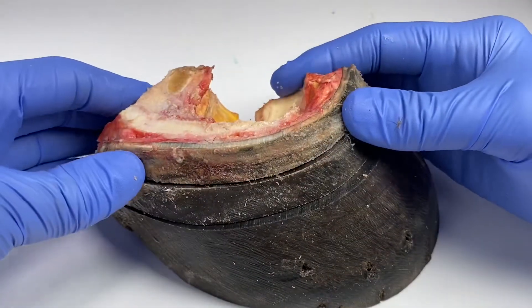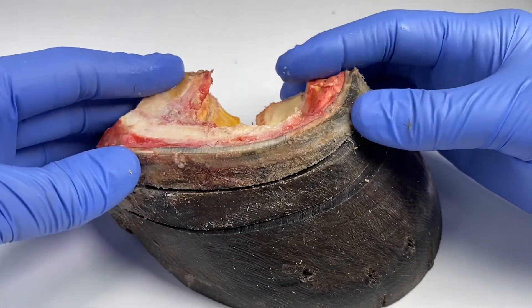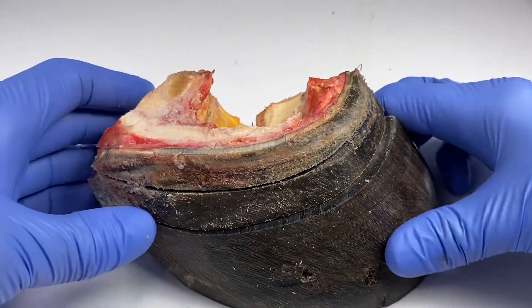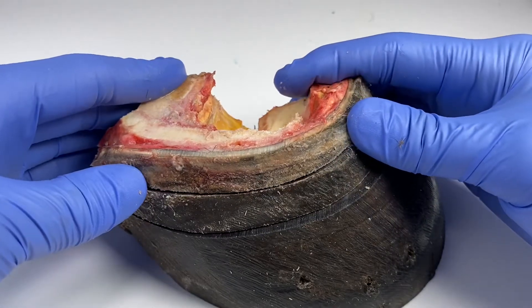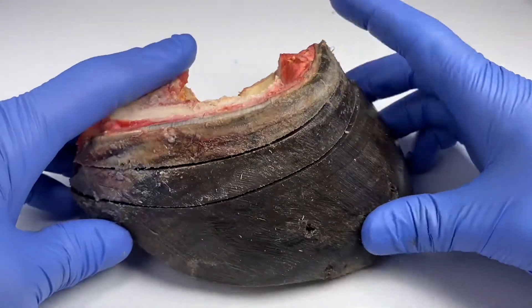I've taken out the navicular bone and also taken out the short pastern, so this is why it's going to look a little bit odd, but I really wanted to focus on some other things with this video. So let me just show you some of the findings.